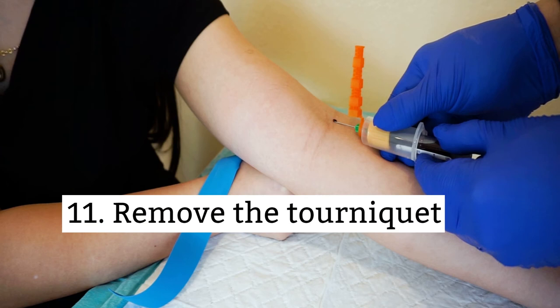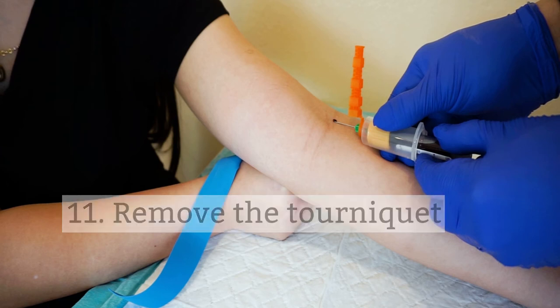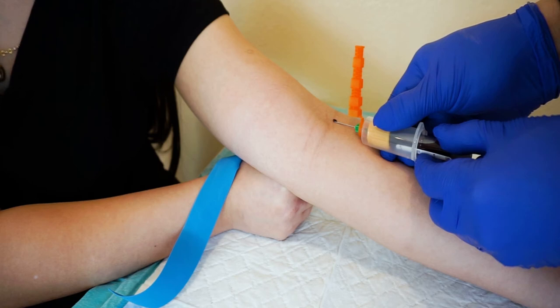Eleven, as the blood is flowing, let the tourniquet go. Leaving the tourniquet on too long will cause hemoconcentration and that will interfere with the test results.